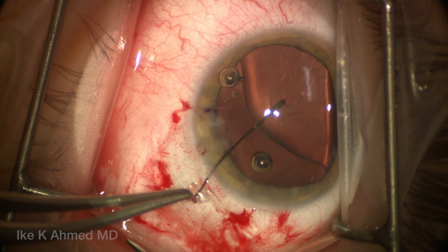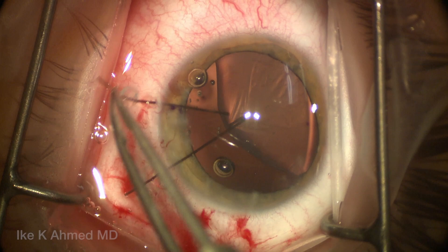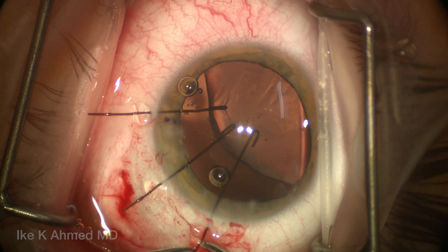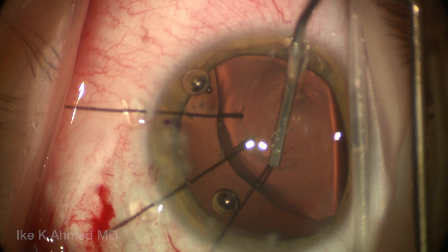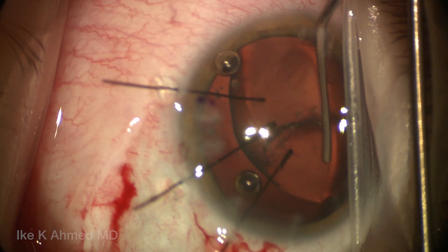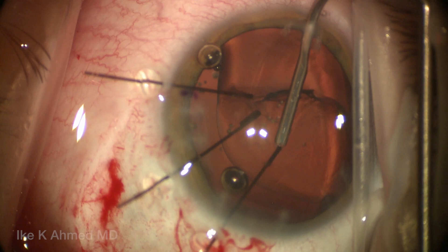The iris retractor is used in a modified fashion on the capsulorrhexis edge. One can use capsule hooks here as well, although when we use a segment there's really no need. Before we put the segment in the eye, it's helpful to have these retractors holding the capsulorrhexis in place, lifting up on it to facilitate placement of the capsular tension segment. We're going to use this super viscous OVD again to create some visco-dissection. You'll see how well the peripheral capsular bag expands with the cohesive agent, separating the cortex from the capsule and creating space for the CTS to be placed in this quadrant — about 180 degrees in the vicinity of the intended placement. Having those iris retractors on the rhexis edge really helps hold that capsule in place during the injection.